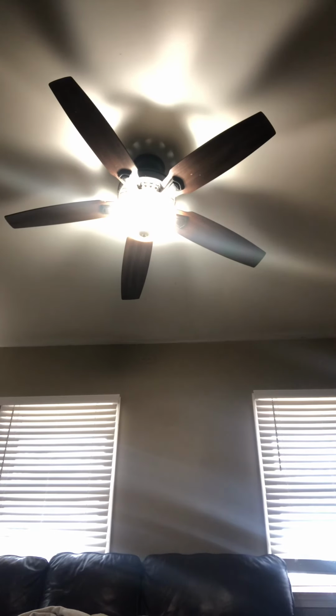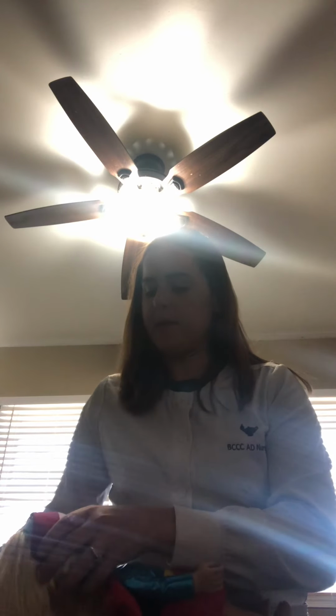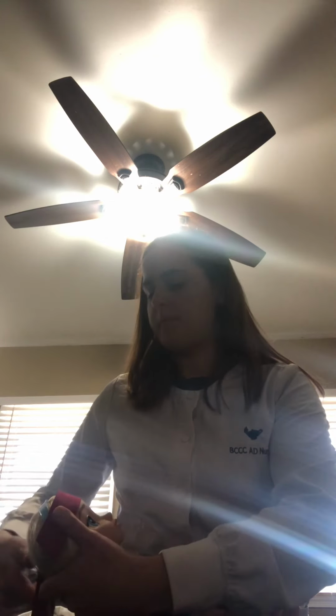So now with the head circumference, I'm going to try to demonstrate that on my doll here. It's going to be about 1 to 2 fingers above the eyebrow, and you'll take your measuring tape. This is my handy dandy measuring tape. Then you're going to put it onto the largest prominence of the occiput. You can usually feel that one sticking out in the back. Obviously the child would be laying down, and you would want to keep them as comfortable as possible. The normal range for that is normally 33 to 38. So this doll has a very tiny head, but you would just want to get the tape around there.